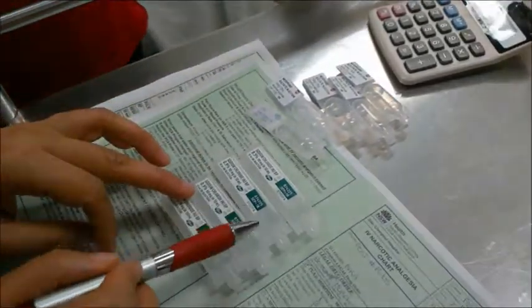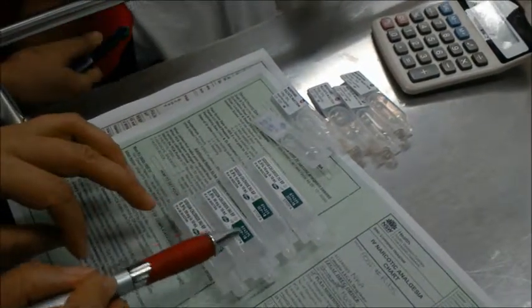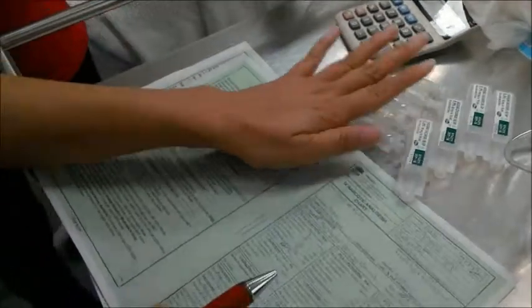0.9 sodium chloride, expiry September 18. Okay, they are within the date.